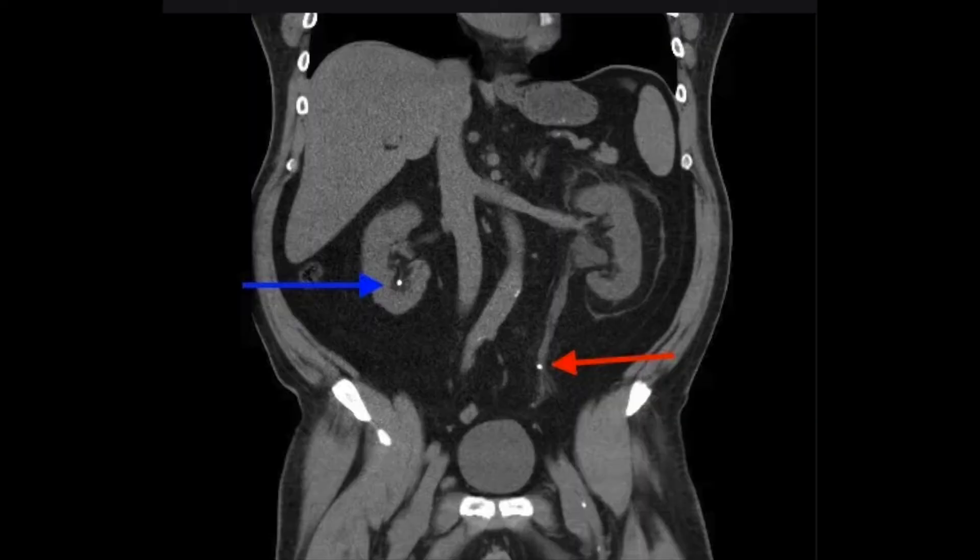In urology particularly we use CT scanning for the investigation of kidney stones. Here you can see on the right hand side, by the blue arrow, a kidney stone in the right kidney, but more importantly on the left hand side you can see a kidney stone in the drainage pipe coming down from the left kidney, which will need treating if it doesn't pass.